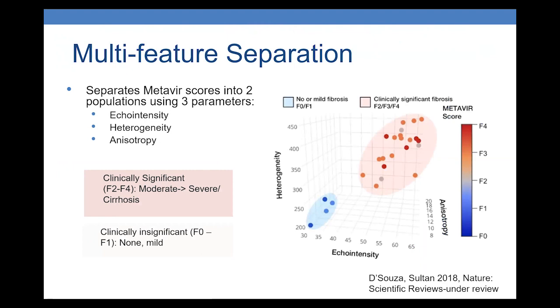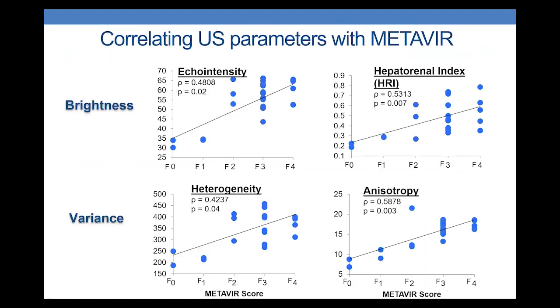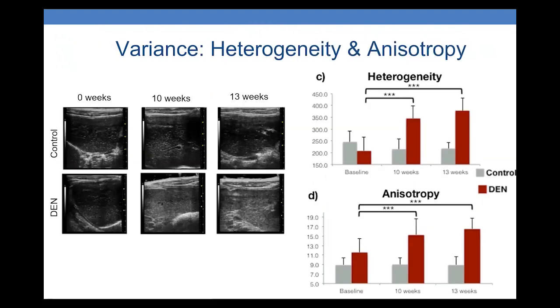Okay, great. I have a couple other questions coming in here. One person says, how do you select the locations for the regions of interest, or is it randomized? We try to choose as much from the liver tissue as possible, trying to avoid any artifacts, any shadowing, and include different places from the image. Then we average them out.